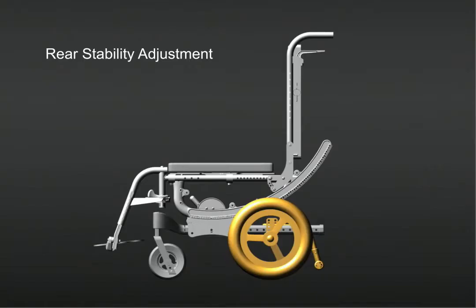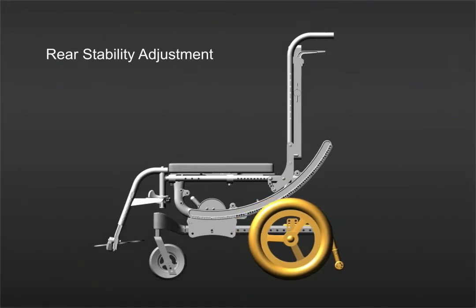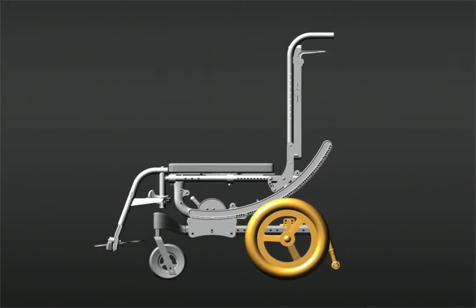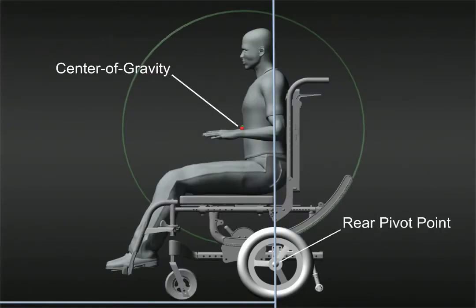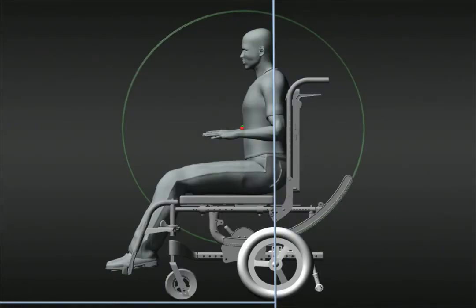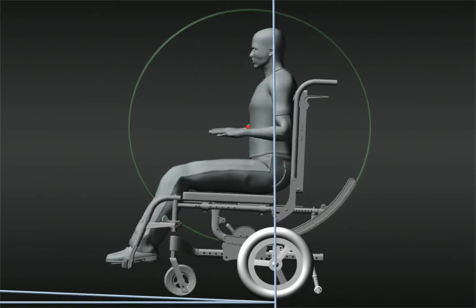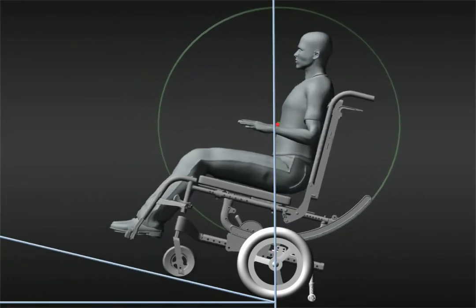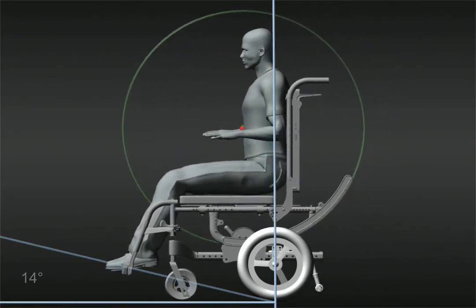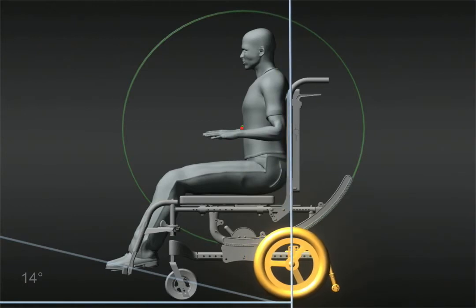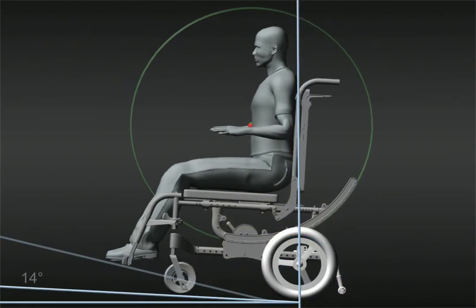The last adjustment capability is rear stability adjustment. This is accomplished by moving the rear wheel forward and backwards on the base frame. In this example, the center of gravity passes over the point of support — the axle of the rear wheel — at approximately 14 degrees. By simply moving the rear wheel rearward on the base frame, you can significantly and easily improve the rear stability.